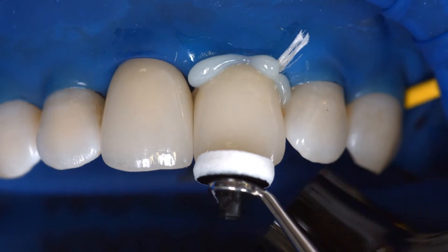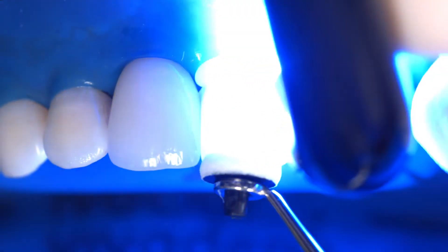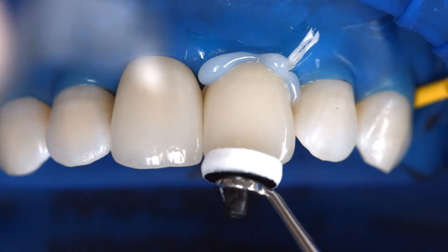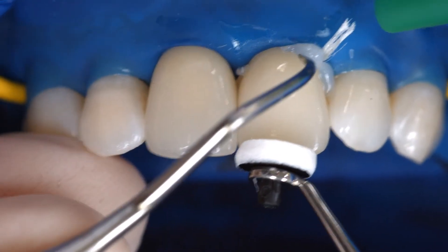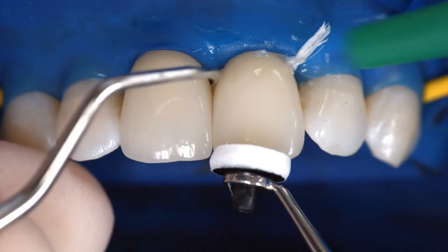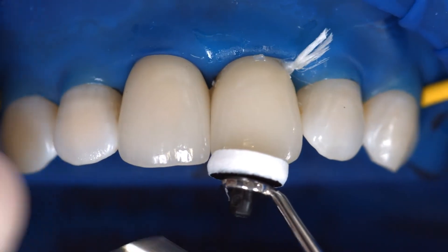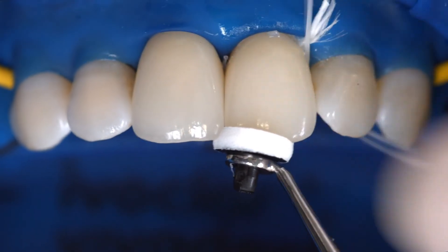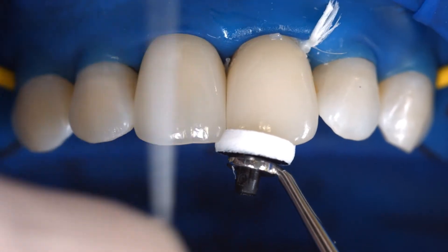Light cure cement excess using the blue phase style, for example. Start with the palatal surface and move the light guide in a circle along the entire cement line in the course of 2 seconds. Make sure that the distance between the light probe and the restoration is between 10 and 15 mm. The gel-like excess can then be easily removed with a scaler and in proximal areas with dental floss.